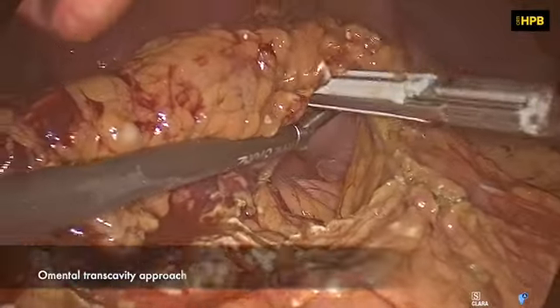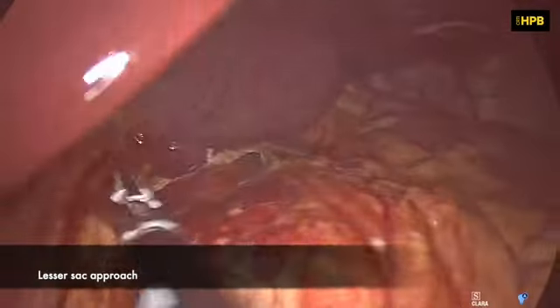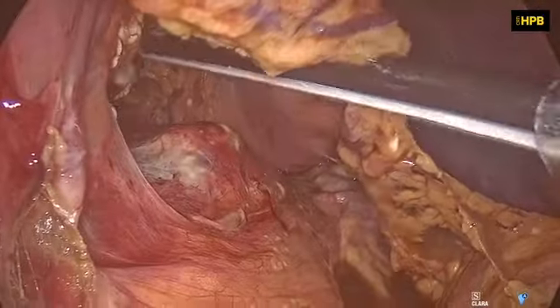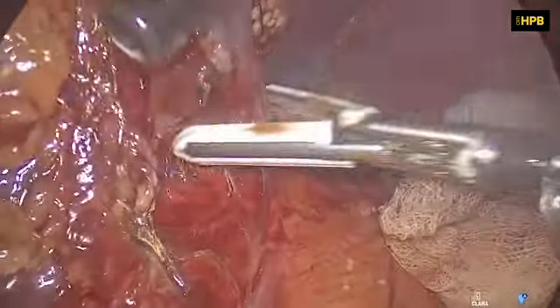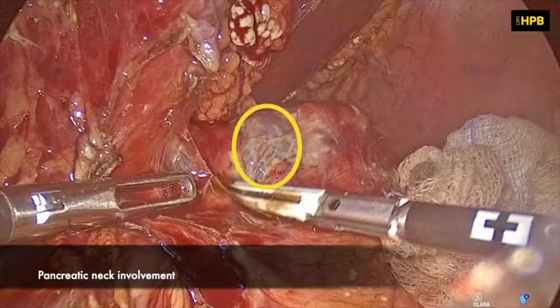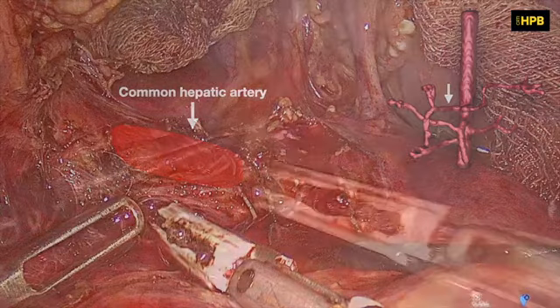The surgery began with the access to the omental cavity, followed by the access to the lesser omentum. Then, the stomach was suspended using 2 umbilical tapes to achieve correct exposure of the pancreas. The pancreatic neck involvement seen in the surgery was also observed in the abdominal CT scan. The common hepatic artery was identified and dissected, as it can also be seen in the 3D reconstruction.